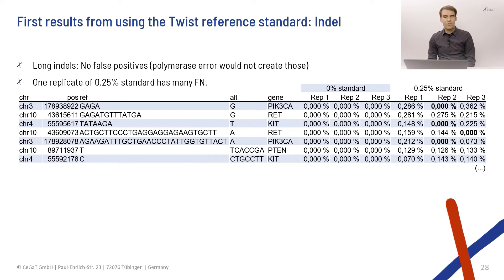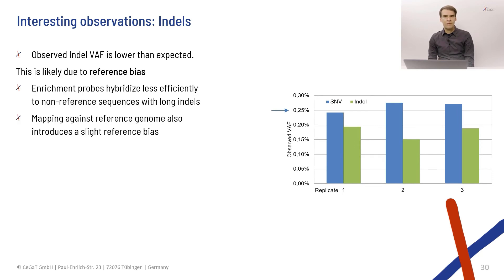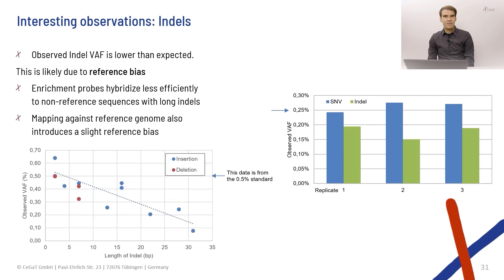One of our three replicates in the 0.25% standard has a lot of false negatives, which is a reproducibility issue we'll have to investigate further. Another interesting finding is that the average allele frequency observed for indels is lower than for SNPs across all replicates — the SNPs are at the expected frequency while indels are lower. Our theory is that this is due to reference bias: the probes used for hybridization-based target enrichment bind less efficiently to DNA molecules containing insertions and deletions, and longer indels are captured even less efficiently.